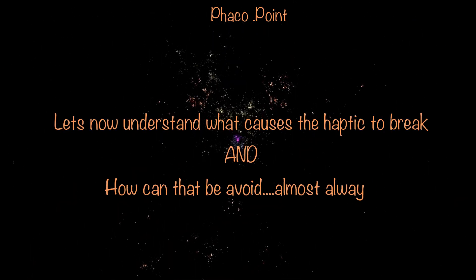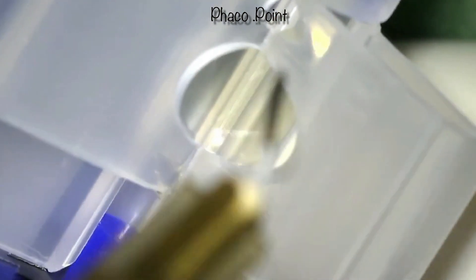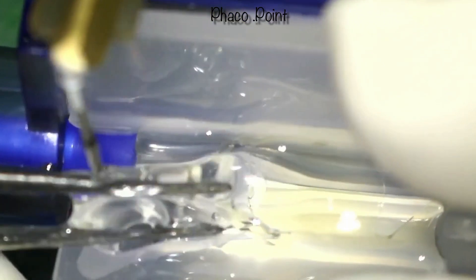At this point, I'd like to address why the haptic ends up breaking. While loading the IOL, we must be extremely careful that not only is the optic well within the cartridge, but we also need to ensure that neither haptic gets trapped prior to closing it. The leading haptic must be well within the nozzle, beyond the part of the cartridge that closes. I always make it a point to take the trailing haptic, lift it up, and fold it within the body of the optic prior to closing the cartridge. In this manner, I am able to almost always avoid any accidental trapping of the trailing haptic between the plunger and the cartridge wall.